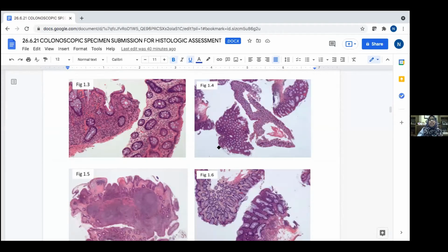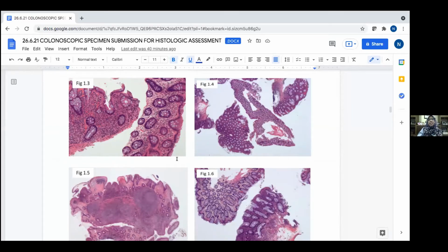In contrast, in the case of Crohn's disease, you'll see involvement of the mucosa with intra and inter-area variation. Within the same area, or intra-area variation, it can involve different fragments as well as within the same fragments. So these 3 pictures show variation in involvement of different fragments.